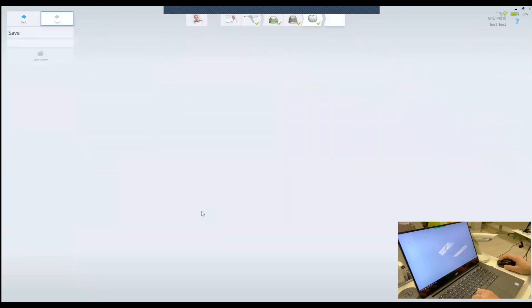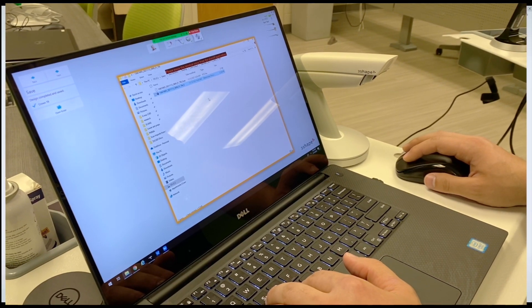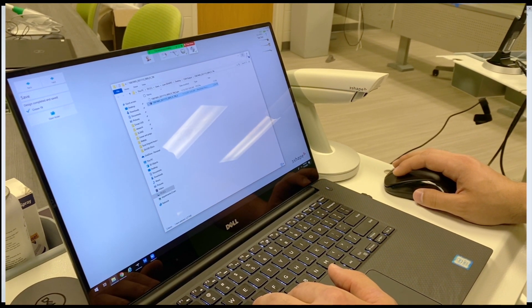So we just go next and we will have the crown file here like this, and the crown will be ready to mill in the lab upstairs.